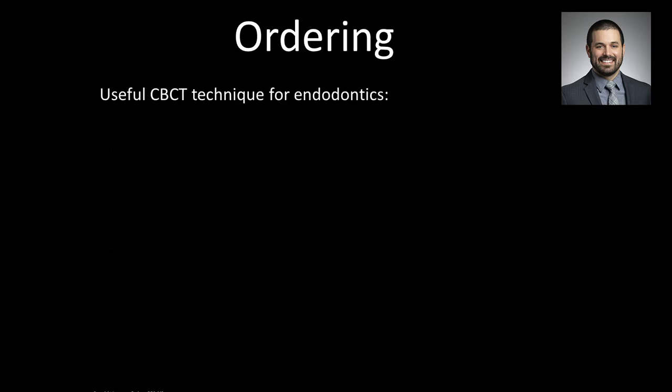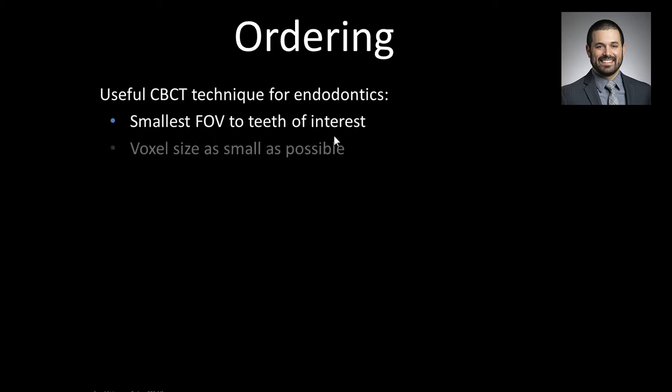Very good. So let's talk about useful CBCT techniques for endodontics. We touched on this briefly last week, but we're commonly going to select the smallest field of view to the teeth or tooth of interest, and that will allow us to get the voxel size as small as possible. So we're going to have as high a resolution as we can.